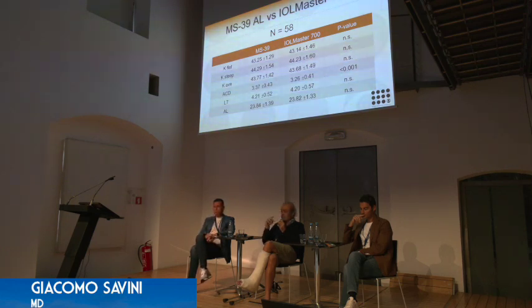And this made the measurements of the original IOL Master for ACD shorter than all other competitors. And we know that the anterior chamber depth is important for some formulas like the Haigis. If the new measurements from swept source OCT would not have been adjusted by ZEISS, probably some constants on the ULIB website would not be valid anymore.